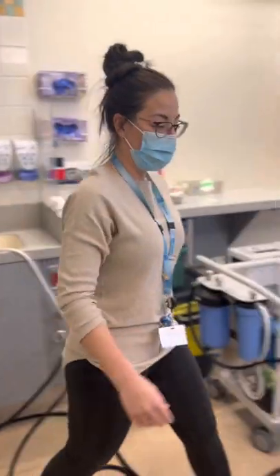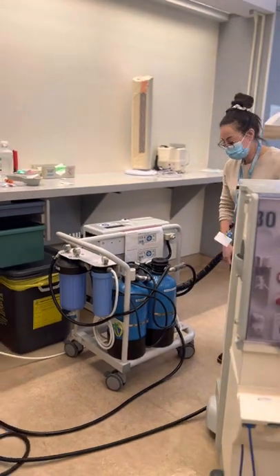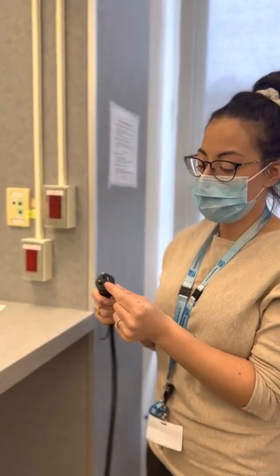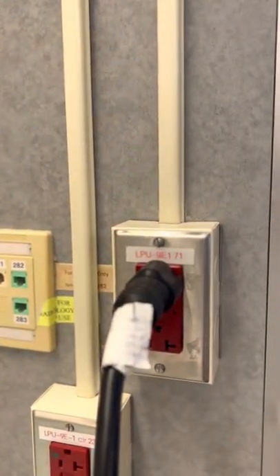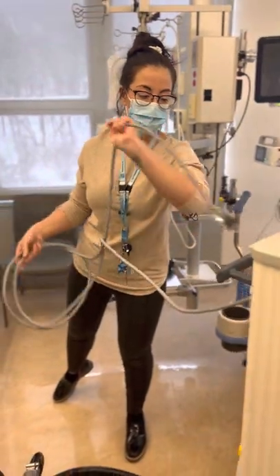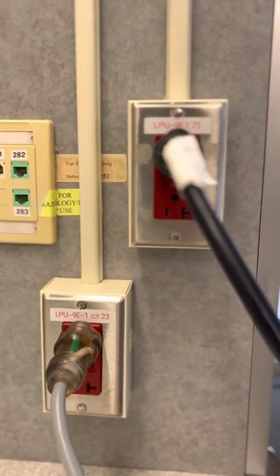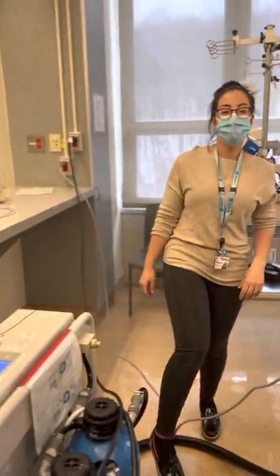Now all of our water connections are connected. The last step is to connect to the power source. Please remember that the dialysis machine and the Aqua Uno have a different plug type — it's almost like an oven plug. Please make sure you're using the right power outlet. Once connected to water and power, you can turn on your Aqua Uno, put it in supply mode, and then you are good to go with the next steps.